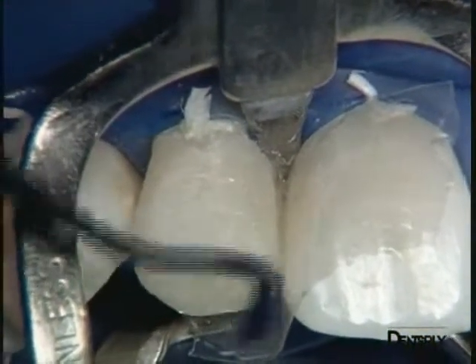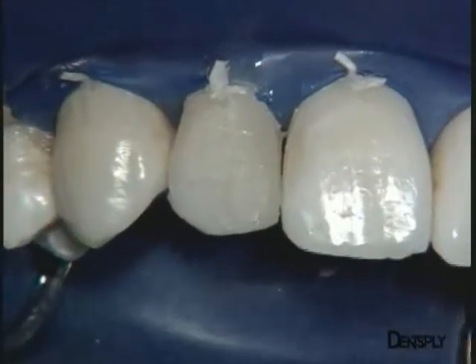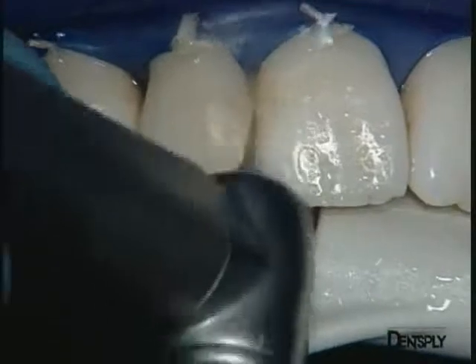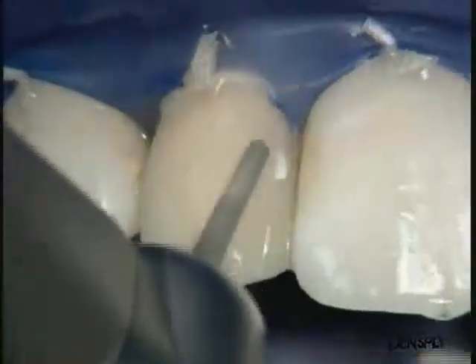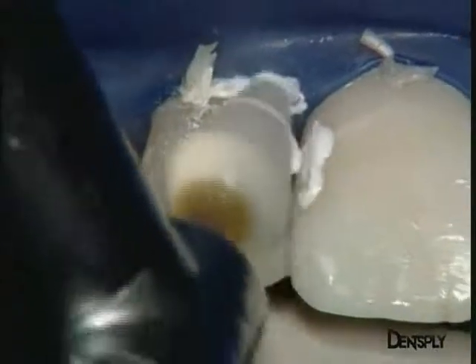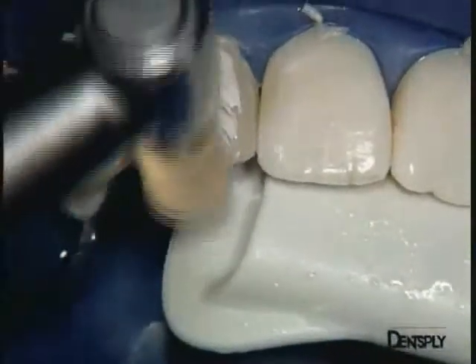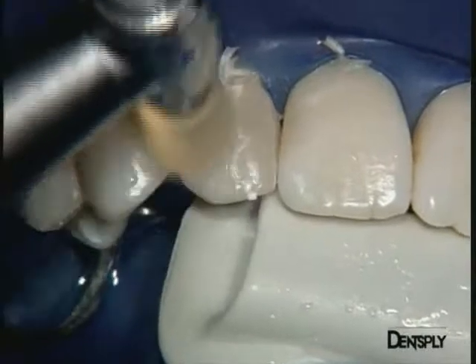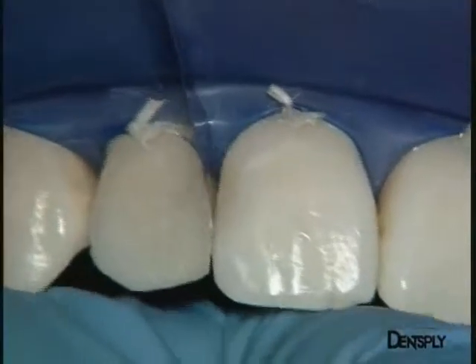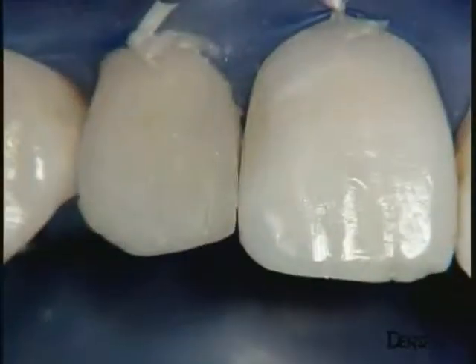It remains to build up the area of the free edge a little. At this stage, before polishing, it can already be seen that our composite restoration blends in very well with the rest of the tooth. Polishing begins with red ring diamond burrs, followed by the Enhance kit — starting with the Enhance finishing points and Prismagloss regular paste, then the Enhance finishing cups with Prismagloss extra fine paste. The application of too much pressure is avoided in order not to heat the teeth. It remains to polish the proximal and cervical areas, where very fine metal bands enable remaining excesses to be removed.